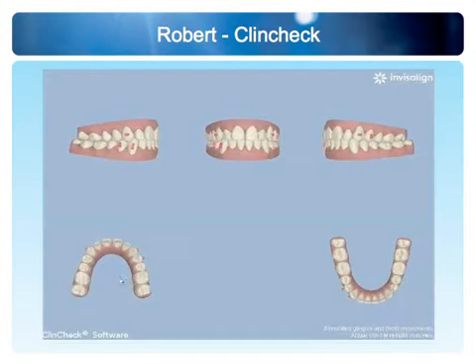So I like expanding, and when this patient measured 25 millimeters to start, we ended up doing 7 millimeters of expansion between upper first molars. The final width across here is now 32, so we went from 25 to 32, and the reason why we are at 32 is because we added a couple of millimeters of IPR, and he does have average-sized teeth.